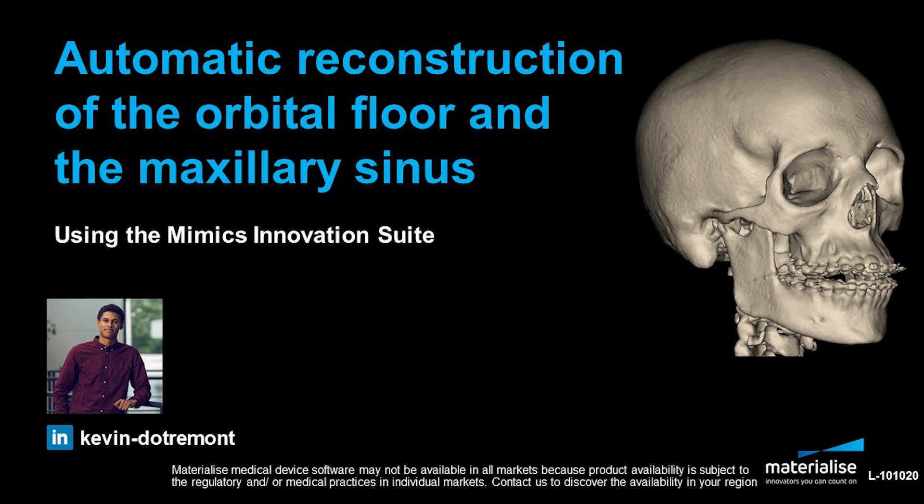Hi, my name is Kevin Dotremont and I'm a medical application specialist at Materialise. This video will cover how to do an automatic reconstruction of the orbital floor and the maxillary sinus for craniomaxillofacial applications using the Mimics Innovation Suite.